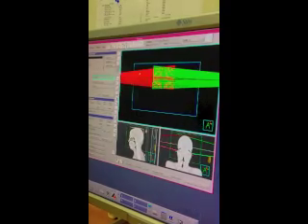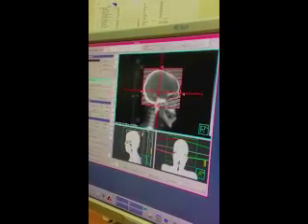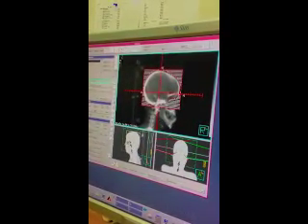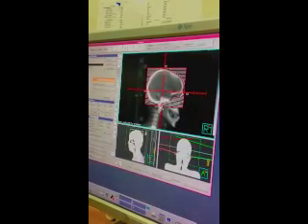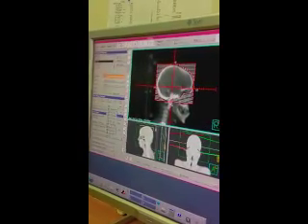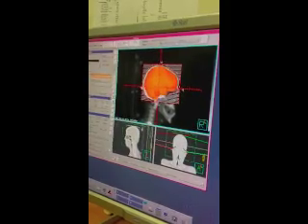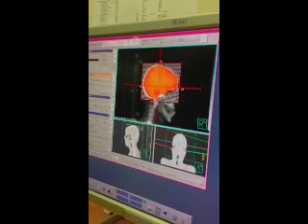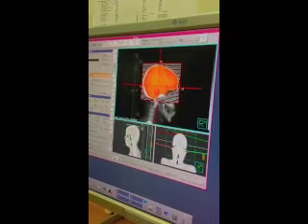This can be displayed then in what we call a DRR, which you saw in CT simulation, which shows the patient's bony anatomy. In the case of this whole brain irradiation, we're going to use the brain contour that we created and put a 1 centimeter margin around it to define our field. These are MLC leaves which will help shape the treatment field itself.